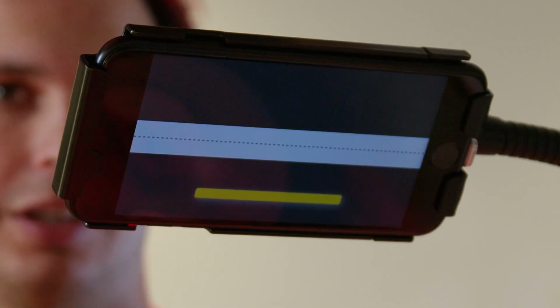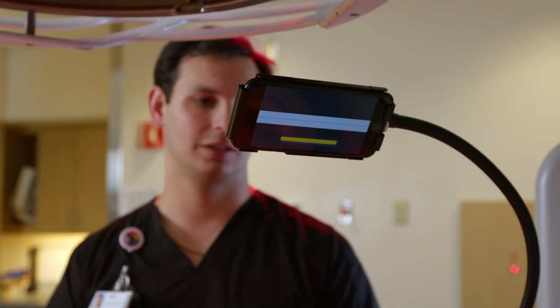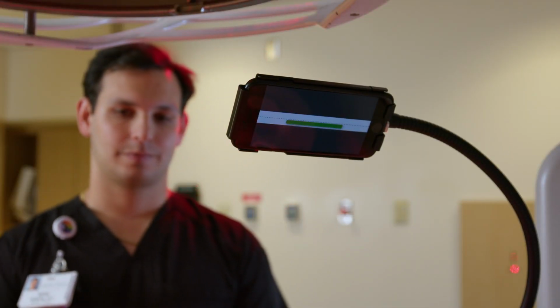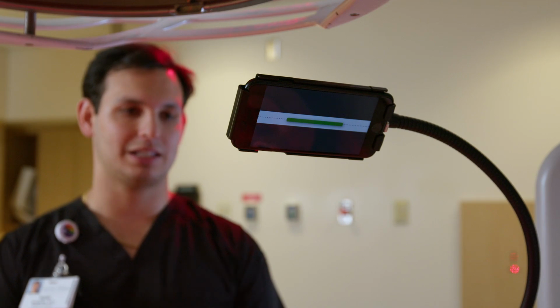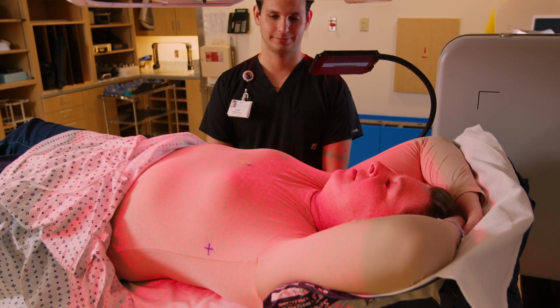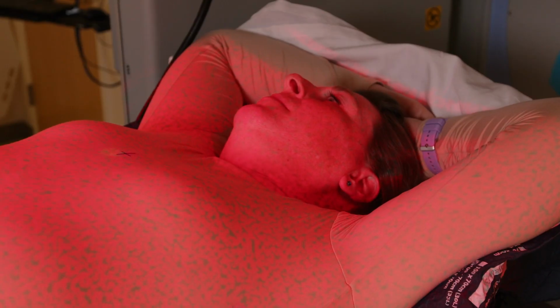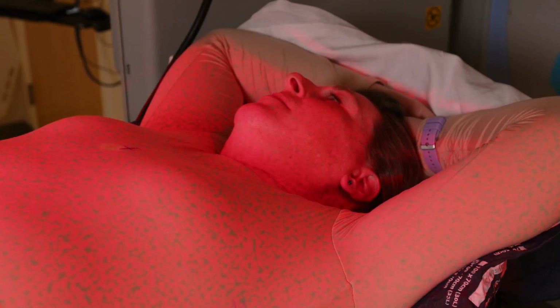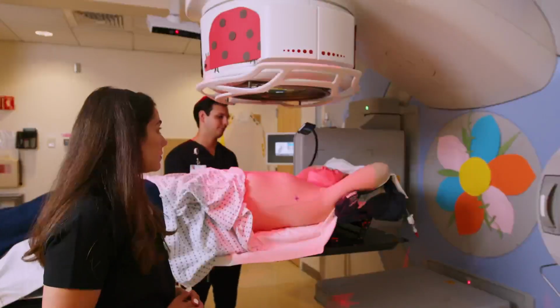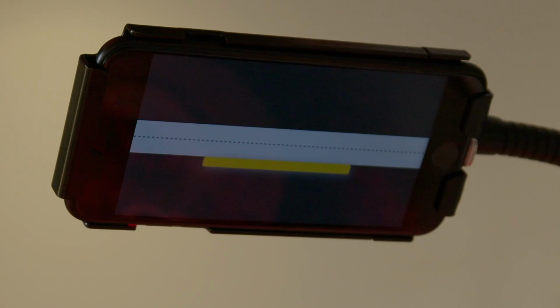You can practice taking a deep breath in through your nose and watch the thin colored bar rise into the thicker bar. Ideally, you want to move the thin colored bar into the center of the thicker bar on the dotted line. It's important to take a deep breath in through your nose and not arch your back. This helps to expand your chest for treatment. As a reminder, our goal is to fill your lungs as opposed to taking a belly breath. Once your breath hold is in range, the therapist will tell you to breathe. Remember that the colors on the bar can change, and that's okay.